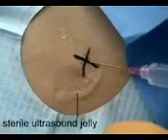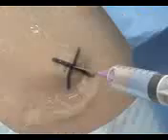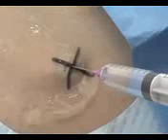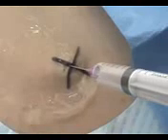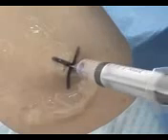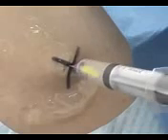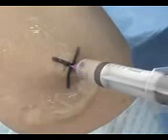anesthetize the superficial skin with a wheal of local anesthetic such as lidocaine. Continue to anesthetize the deeper tissues in the anticipated tract of the paracentesis catheter, intermittently pulling back on the syringe every 2 to 3 millimeters. Once peritoneal fluid begins to fill the syringe, inject additional anesthetic to anesthetize the highly sensitive parietal peritoneum. A total of 5 to 10 milliliters of lidocaine is generally used.